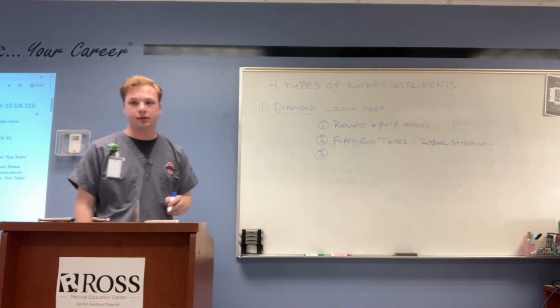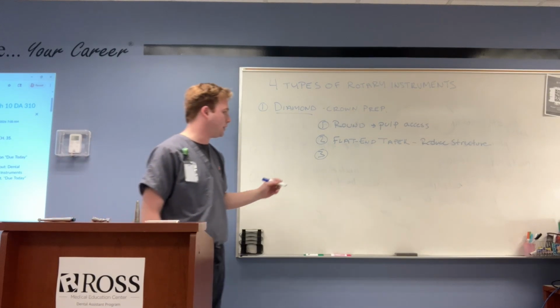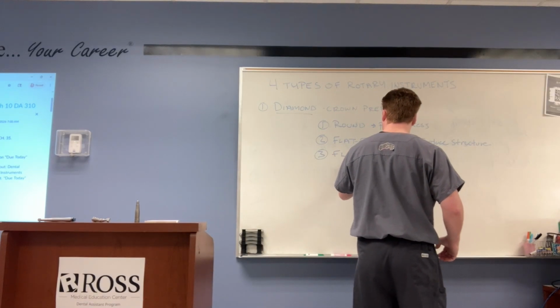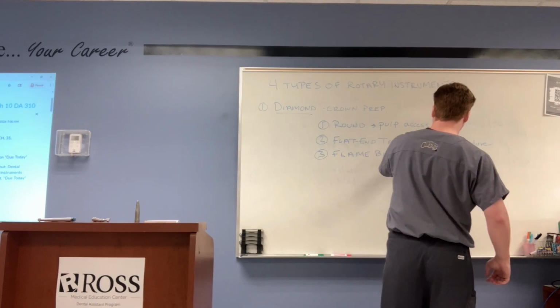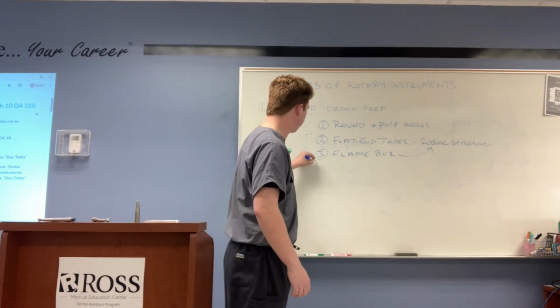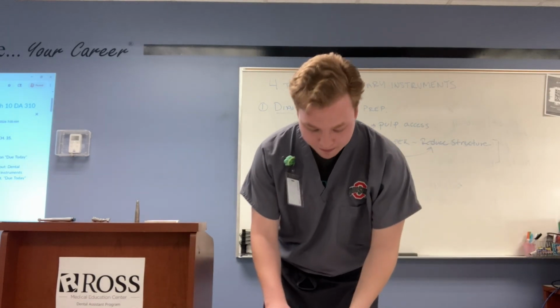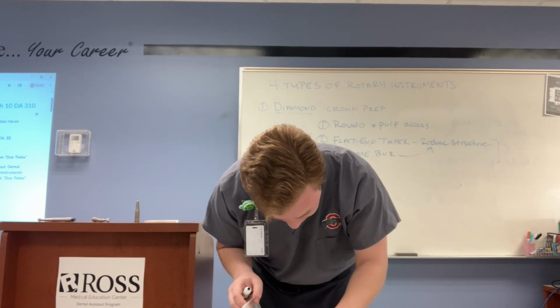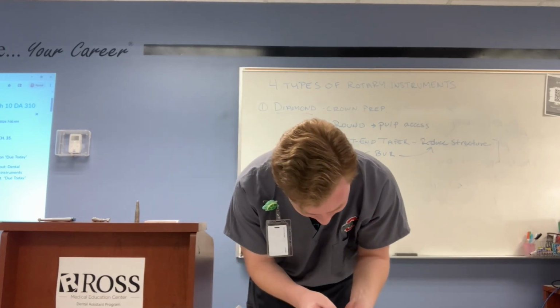The third one is kind of a freebie, but this is the flame burr. It's used very similarly. So the flame burr actually does the same thing. It looks like a little candle flame. You know that also reduces the tooth structure. That flame is common. You should always have that on the burr block. Your doctor, every single doctor I ever worked with, they want that. We call them goldies.